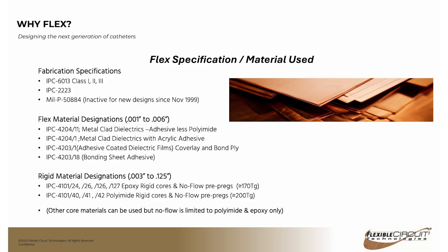If you go to your manufacturer and you specify materials that are not part of their bulk buys, they're going to be paying a premium on those. And you also will have lead time and sometimes just availability issues. So it's important to specify per the IPC specifications, and any material that's specified for the IPC specifications will be a drop-in replacement. So you're not really losing anything as far as value on those materials.